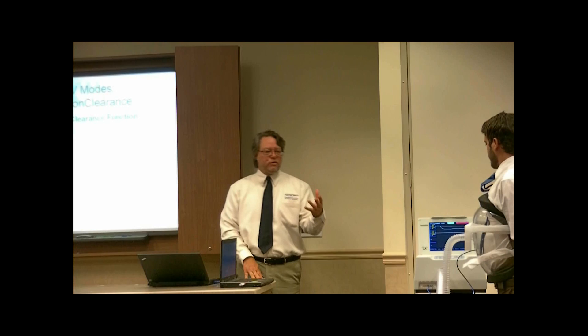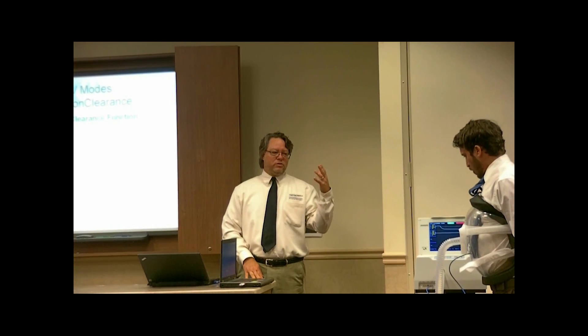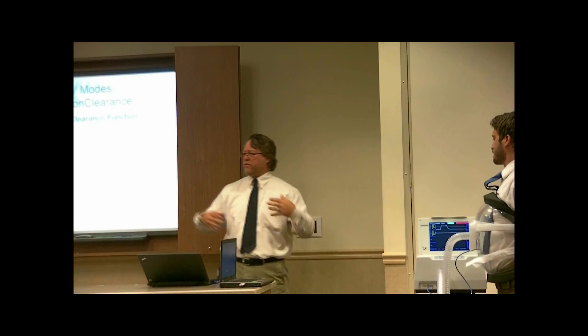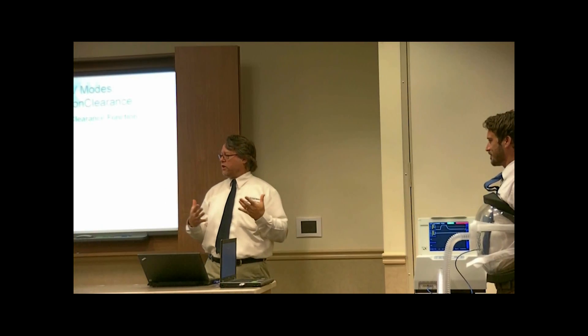I'll coach the patient as it's pushing. One, two, three, and I'll get him to cough with that positive pressure breath. And you just get this dramatic increase in cough flow.